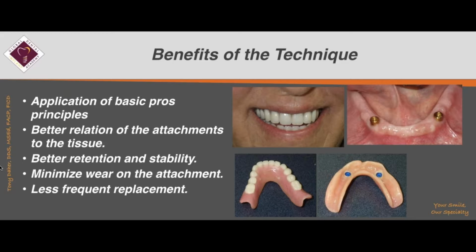Remember, with a sticky food, the patient bites on it, opens the jaw, the food is going to grab the denture, and by opening their jaw it is going to lift up the prosthesis. This is the time this implant is going to help to retain the denture in place.